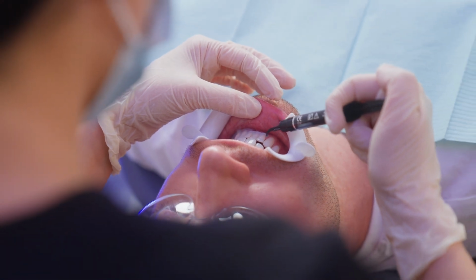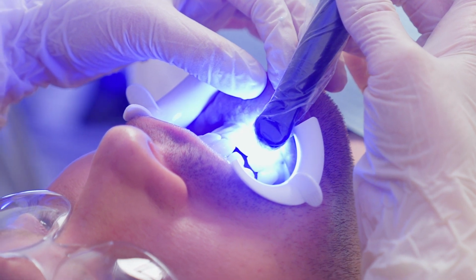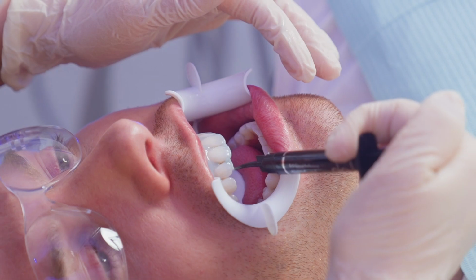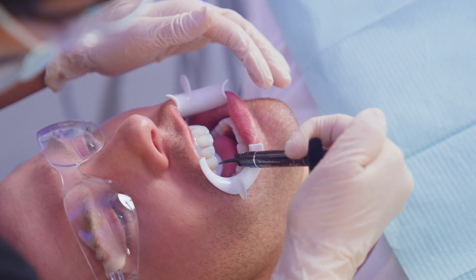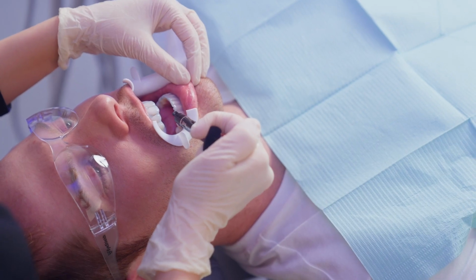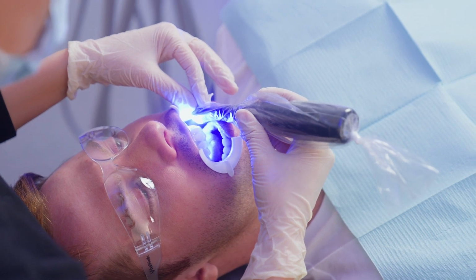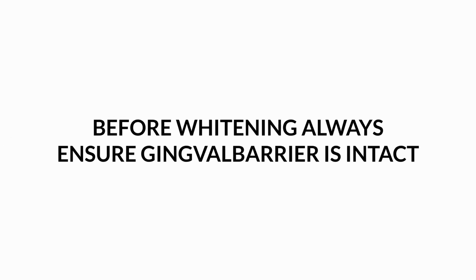Continue applying the gingival barrier to the next arch, air drying and light curing along the way. And finally, apply a thick layer of barrier along the incisal edge from premolar to premolar on the max and mandibular arch. Make sure no pink tissue is exposed around the teeth, and before whitening, please ensure that the gingival barrier is intact.